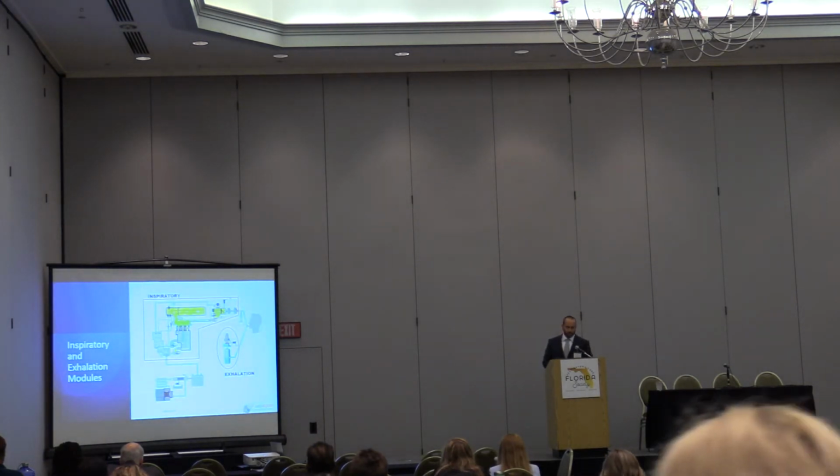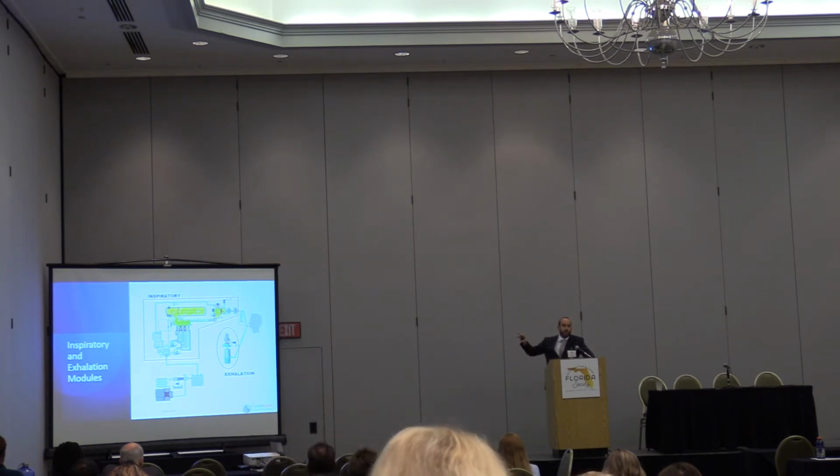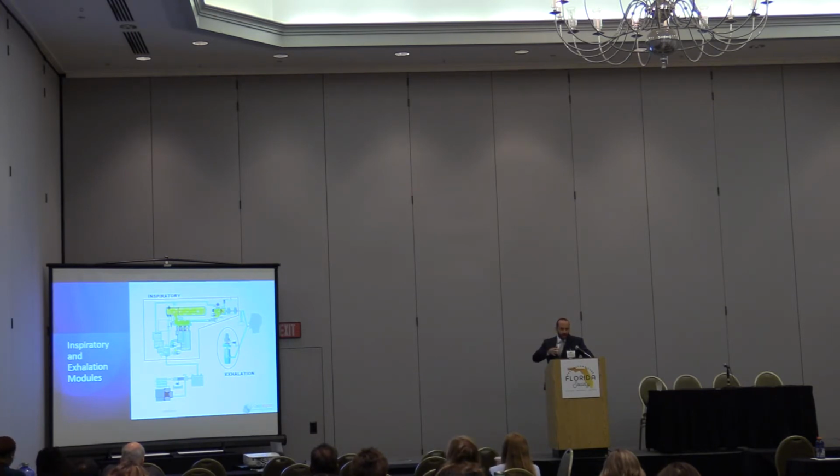So here's a general schematic of the inspiratory module. The red box is your inspiratory module, and it's where the air and oxygen are regulated. A high pressure gas is input, passes through the module, and is delivered to your patient according to the operator's set variables.